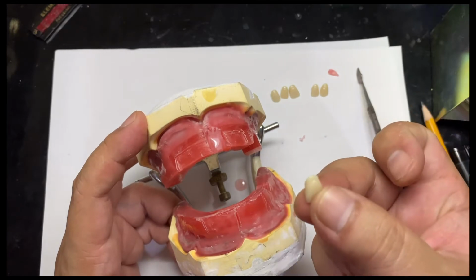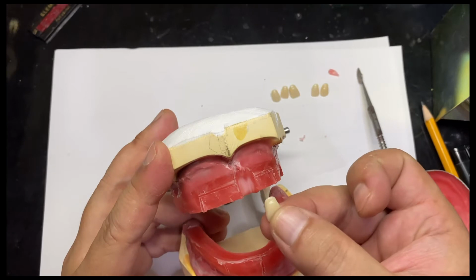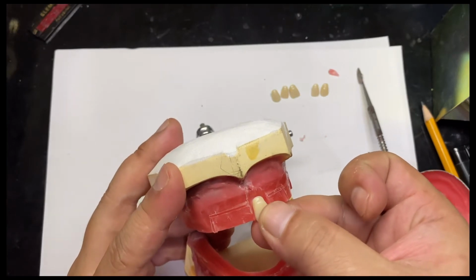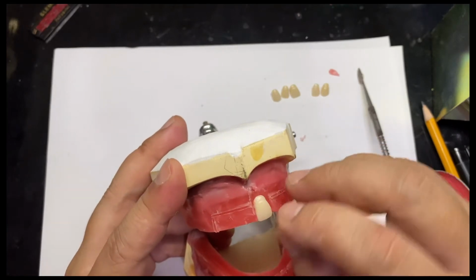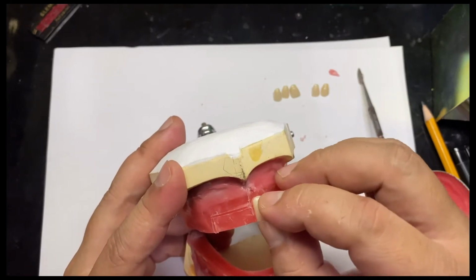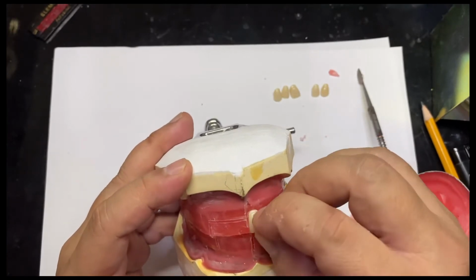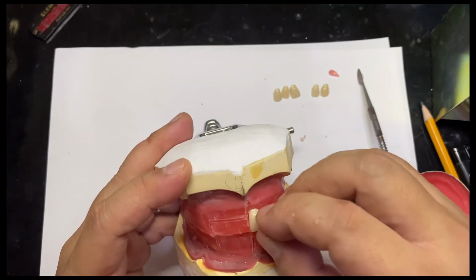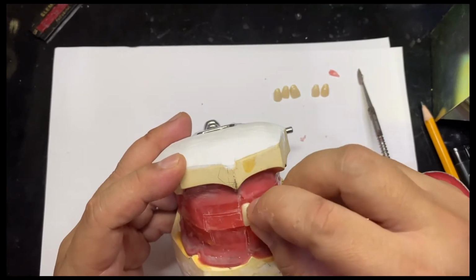Holding this incisal edge of the central incisor, you can easily position the central incisor exactly on the OCR. Always maintain again the midline.